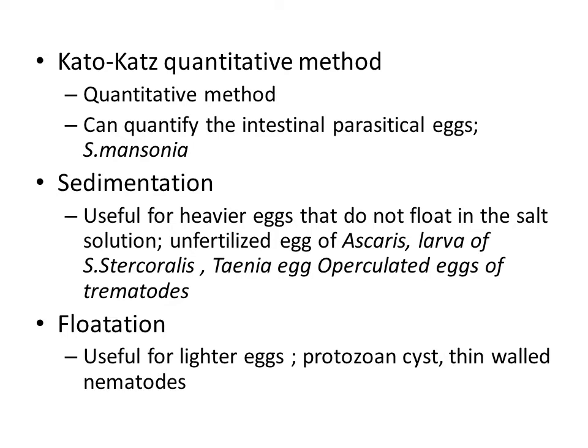We take the deposit and observe it by wet mount or permanent stain. Examples are the unfertilized egg of Ascaris, which is very heavy so flotation cannot detect it, the larval stage of Strongyloides, and Taenia eggs. These are examples of the sedimentation method.